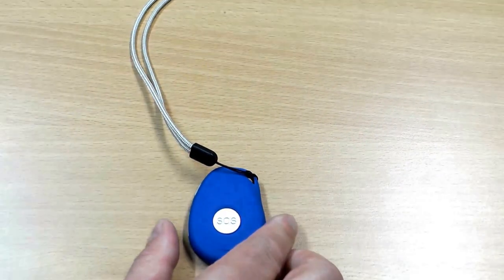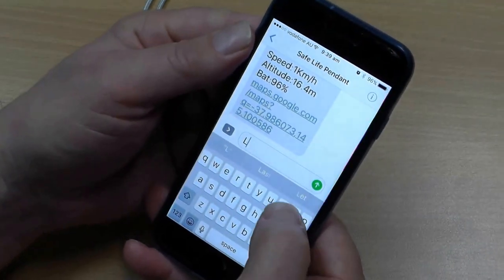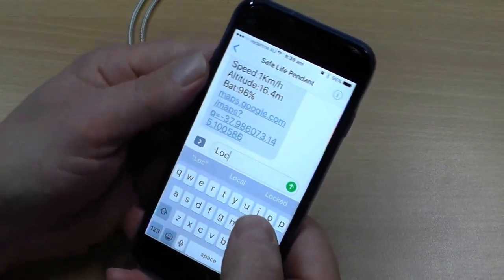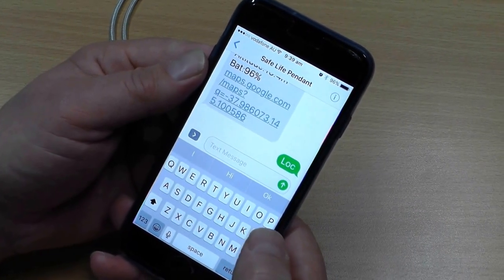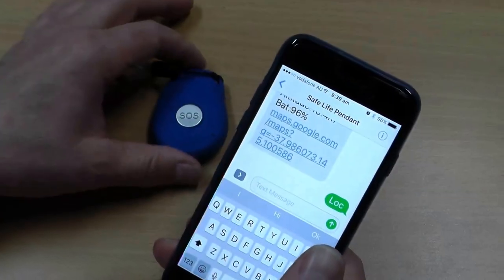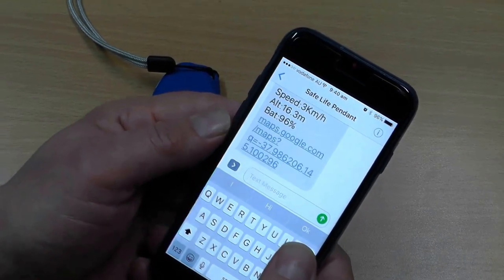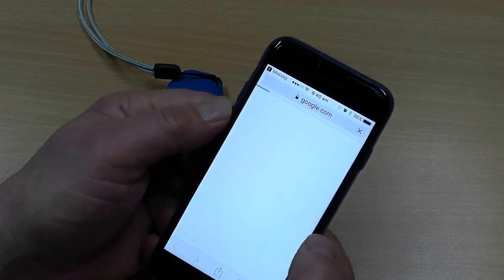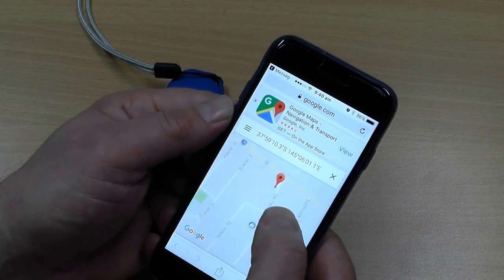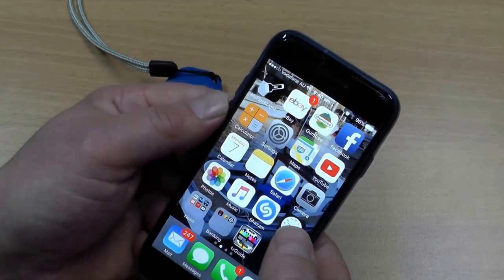What I'll do now is demonstrate a location report with the SafeLife Pendant. That's easy to do — I text the word LOC for location and then press send. It will respond by sending me back a message which also has the Google Maps coordinates in it. There we go, so this is the message I've just received. If I tap that it takes me to Google Maps and again shows me the location of the device, and again I can call back into it and make voice contact.